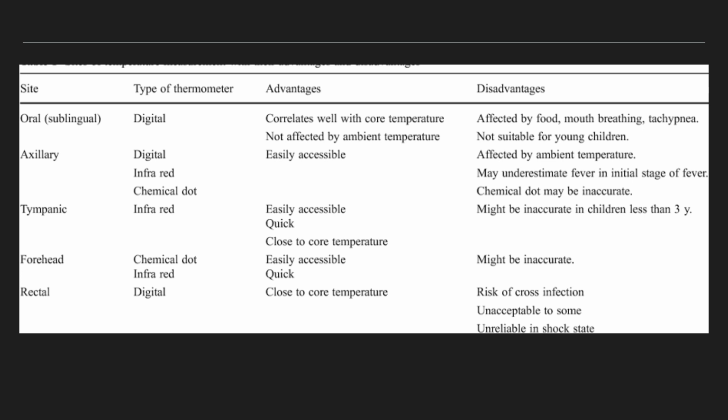Smoking, drinking, and eating, which slightly alter oral temperature measurement, do not affect tympanic temperature measurement. The ear is readily accessible and permits rapid temperature readings in very young, confused, or unconscious clients. Because the ear canal harbors fewer pathogens than the oral or rectal cavities, infection control is a minor concern with the tympanic site. There is some concern that this site may be less accurate than rectal or oral temperature readings.